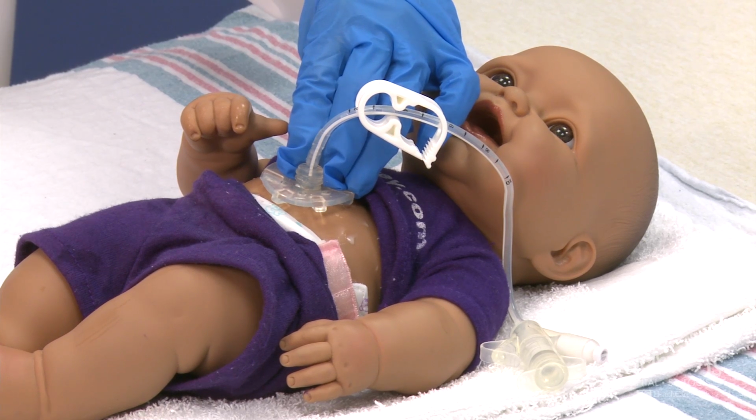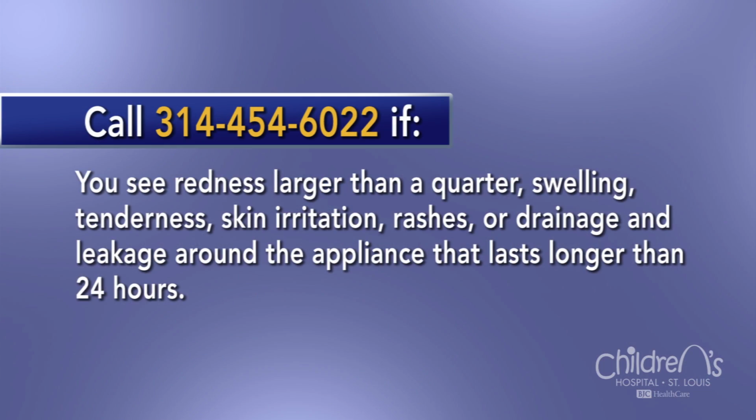Check the site daily for redness larger than the size of a quarter, swelling, tenderness, skin irritation, rashes, or drainage and leakage around the gastrostomy appliance. If any of these occur and last more than 24 hours, please call the surgery office.